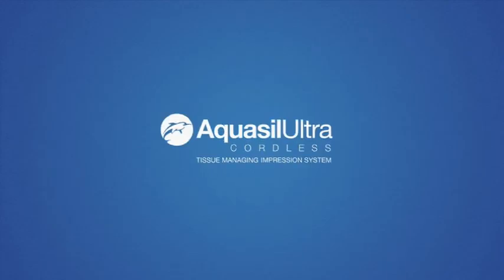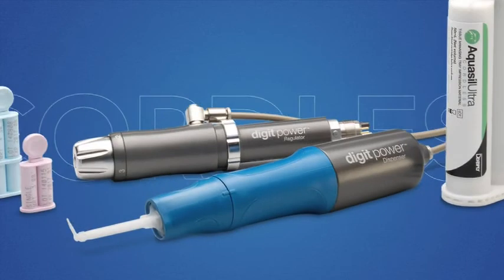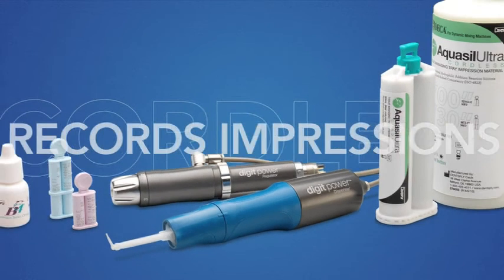Introducing new Aquasil Ultra Cordless. This revolution in dentistry is the first two-in-one system that both manages tissue and records impressions in one step.